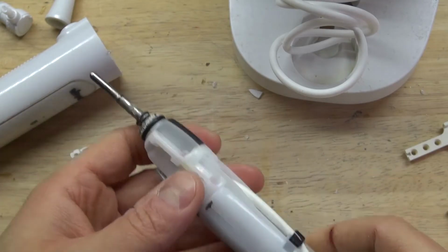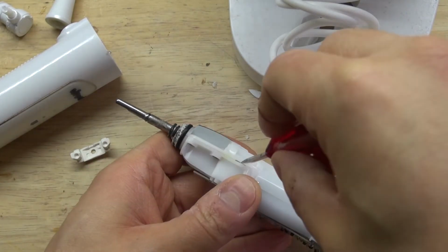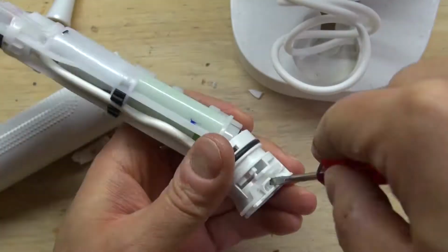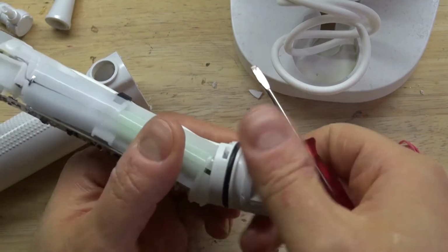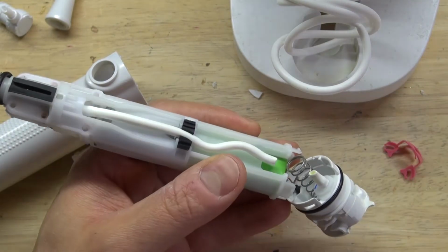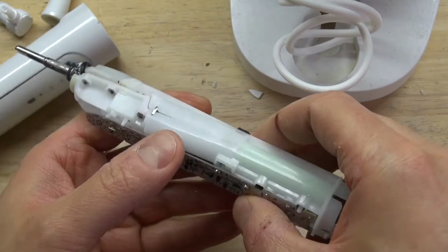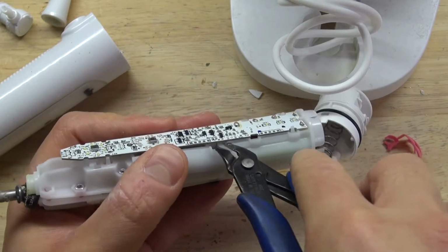Now I'm going to carefully open it up. Separates a little bit, but what I need to do is cut the tube. And there, it comes out just like this. Now it should be easier to open up. Not opening up completely because it's being held down by the circuit, because those wires that are sticking out is what's holding the circuit into place.